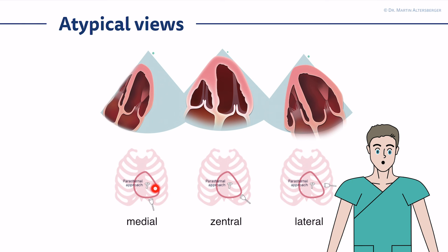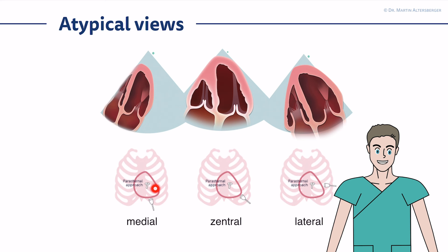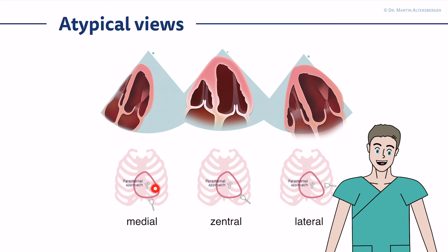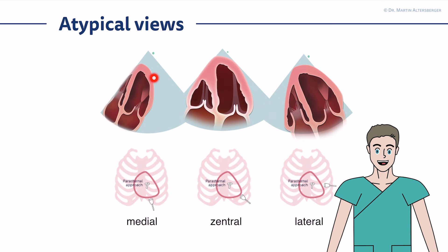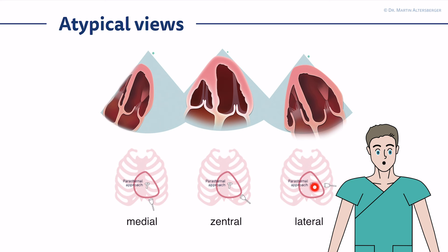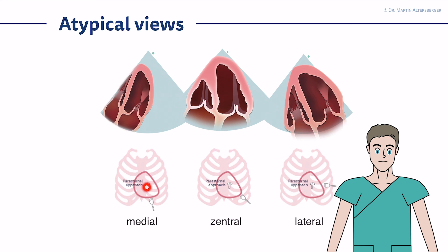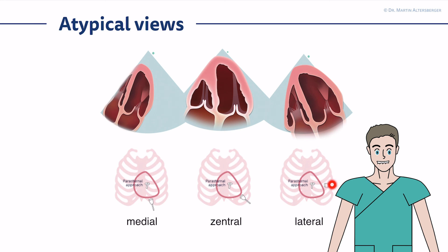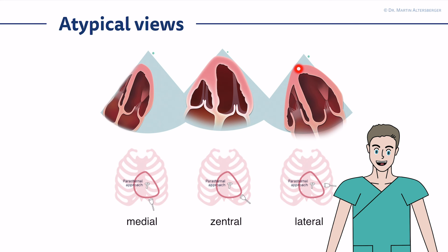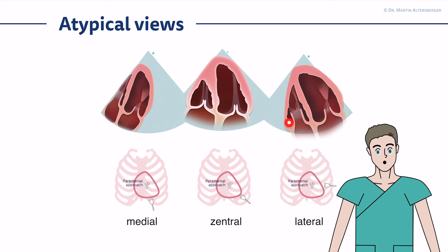I want to discuss some atypical views. Not always can you see everything with the four-chamber view optimally — then it is time to move the transducer. You can move medially so that you see the lateral parts of the left ventricle better, specifically the anterolateral wall. Here you have the traditional four-chamber view, and if you move more laterally and tilt inward, you get a nice glimpse of the right ventricular free wall.